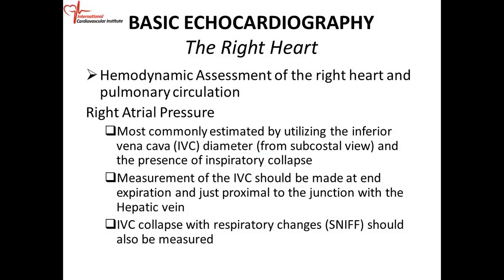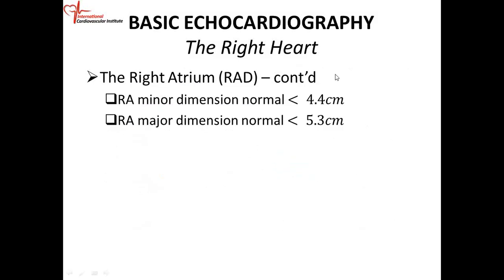And how we do the measurement, we measure the IVC just proximal to where the hepatic vein enters the inferior vena cava. Remember that the hepatic vein, which courses through the liver, empties into the inferior vena cava. Okay? So we call that the sniff test.